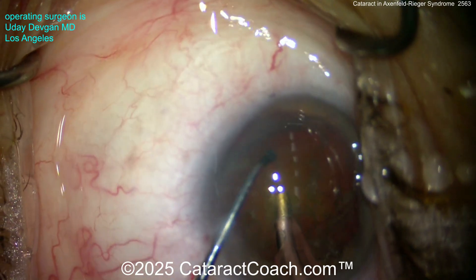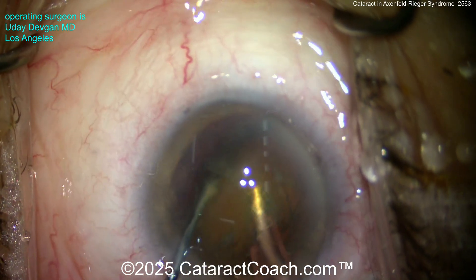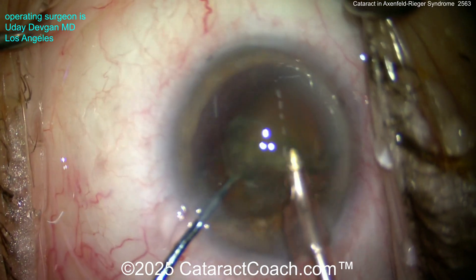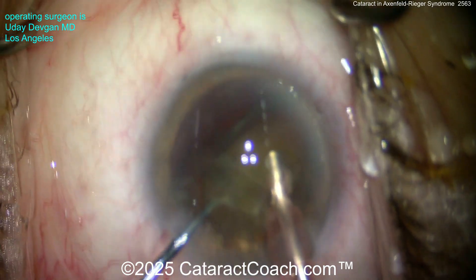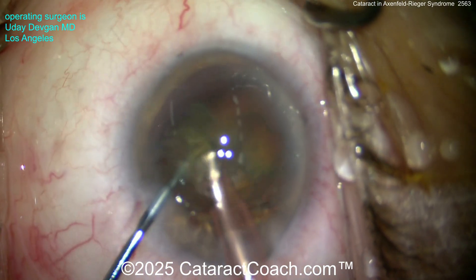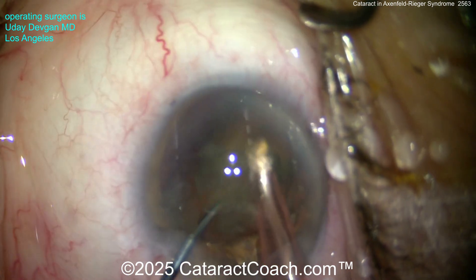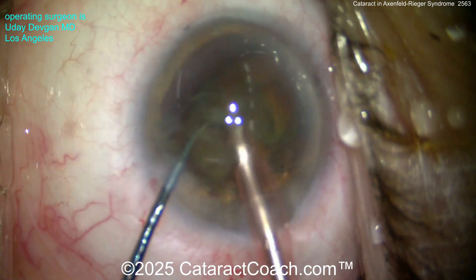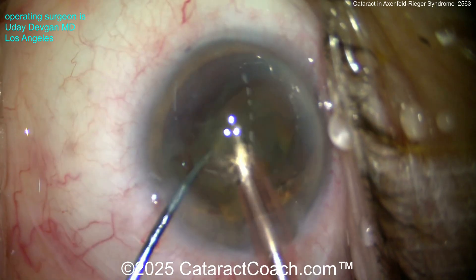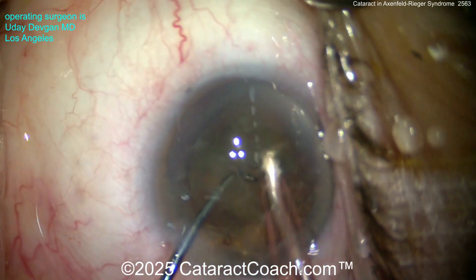We're going to address that astigmatism with a toric IOL, which will partially address it. The patient also wants to remain myopic. Now I'm going to buzz in and get that nucleus — going to chop it. I buzz into the nucleus, we've chopped it, and now we remove the cataract pretty easily.